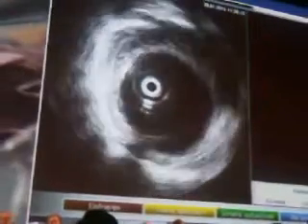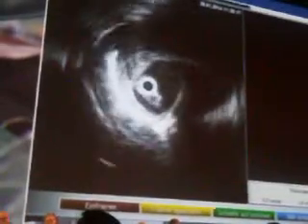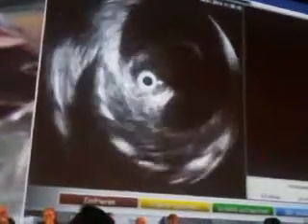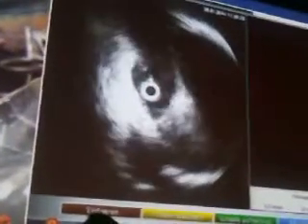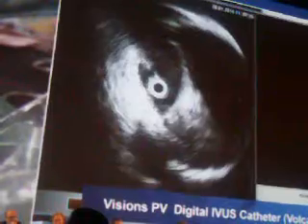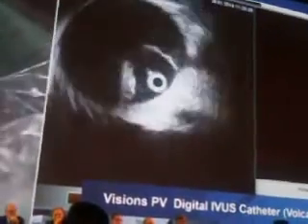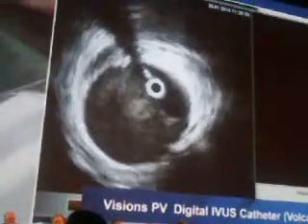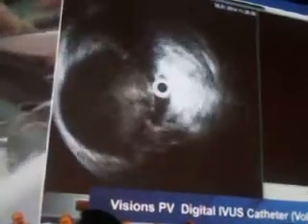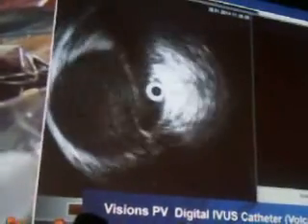If I go further down, you can see that this lumen gets more narrow. That's what we have seen on CT, that the true lumen is the small one, so we are right here. When I go further down, just a moment, this should be the trunk.